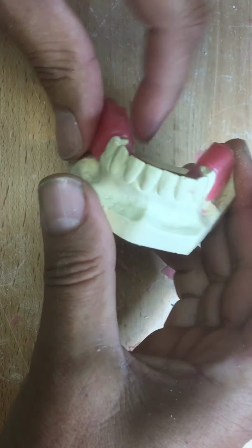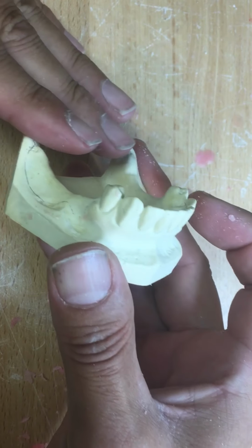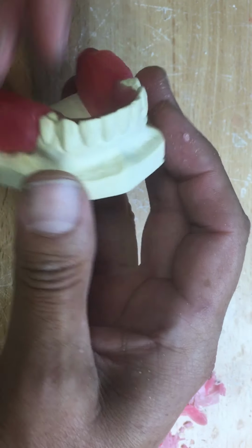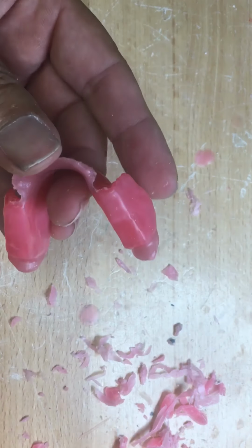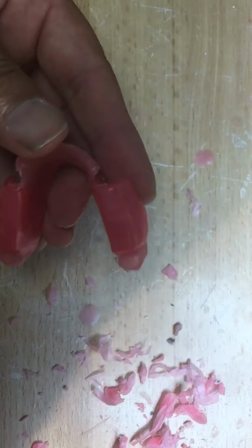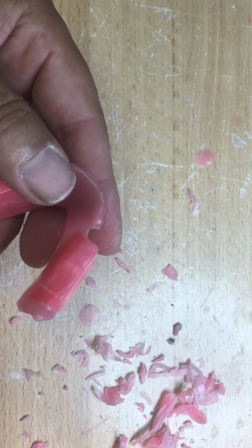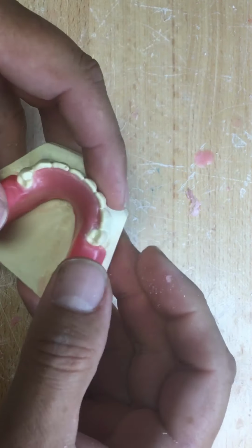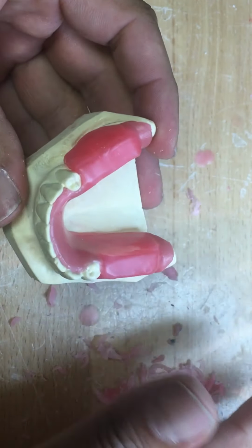Many practitioners will try to get away without this. They say, well, you can freehand articulate, the patient's got full dentition, and it kind of locks in there. That's fine too, but just be wary that if there is any small chance that you can't register that centric occlusion positively, then I think this would be an interim step. Make a partial occlusion rim, establish the bite, mount it, create the framework, and then move forward with setup for try-in and then process to finish.